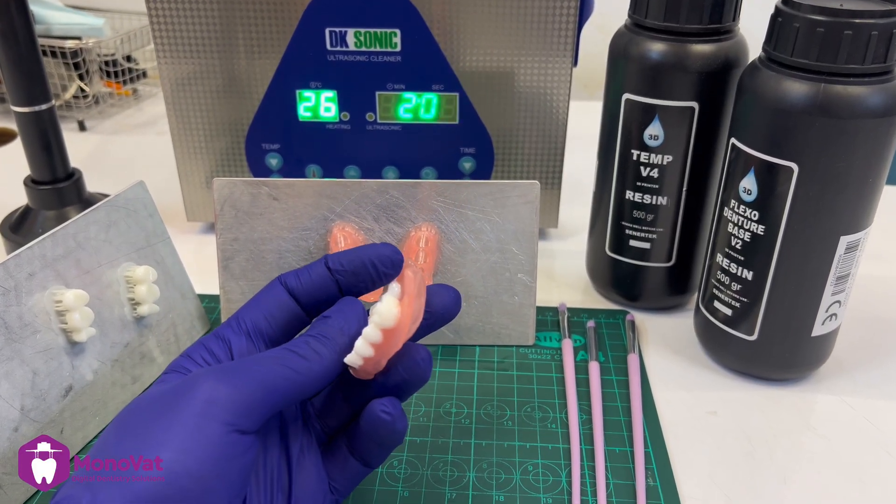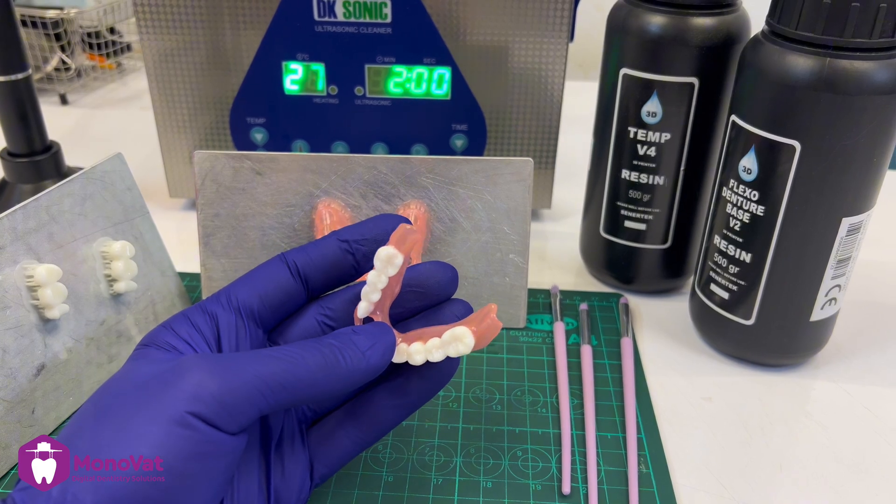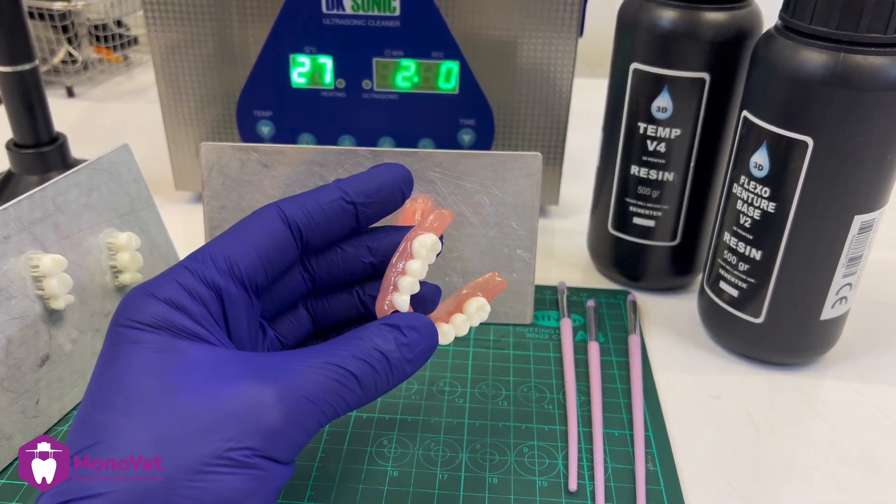Hi, it's Al Hakem from Monovat. Today we will learn how to glue the teeth with the denture and how to give it this shining, beautiful view.